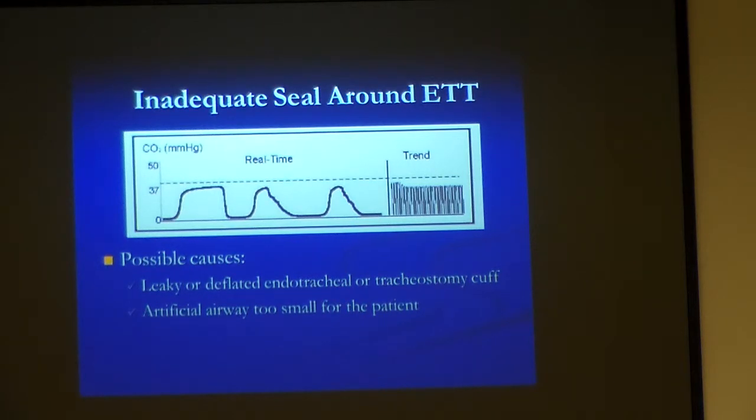Obviously, if you can still maintain and get to the hospital where they can change it out, that's great. If not, and you start losing your end-tidal altogether, you need to take your tube out and go ahead and bag the patient. You're better off that way. But that's the kind of waveform you're going to see. They call it a shark fin presentation, where it looks like a shark fin. You'll see that in patients where maybe the seal is not adequate.